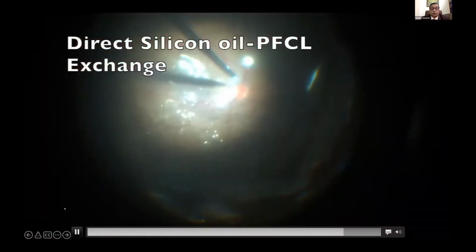Now, the other important thing is you can see there's a direct silicone oil PFCL exchange. Whenever your retinectomy is more than 180 degrees, it's preferable to do a direct exchange to prevent slippage. And the other important thing is when you do a direct PFCL silicone oil exchange, put your cannula at the tip of the PFCL, not at the bottom of the PFCL. Otherwise, you may get a premature removal of PFCL and then you'll get a slippage.